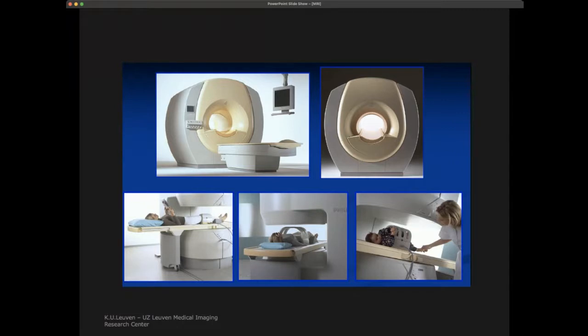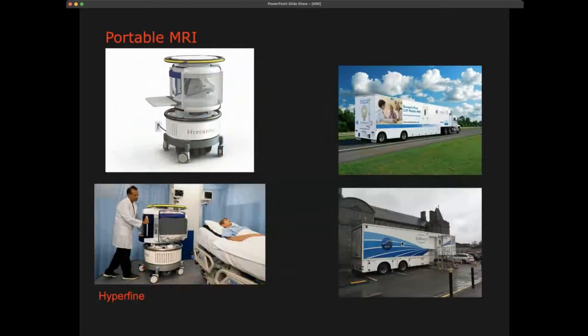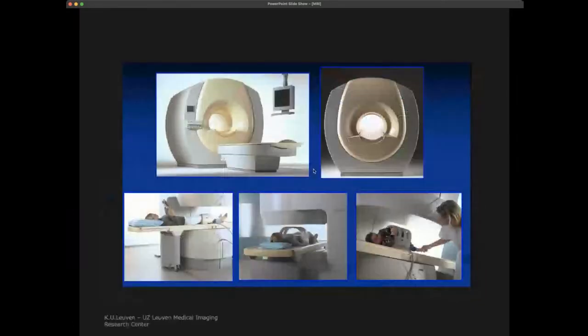And one of the things that you start to see here also is that we use the main coil in order to generate the magnetic field. But what we often do is we use very specific coils in order to do the measurements, because the closer we can go to the body, the better our signal to noise ratio will be. And so based on this, you will have different coils, which I will show in a minute.